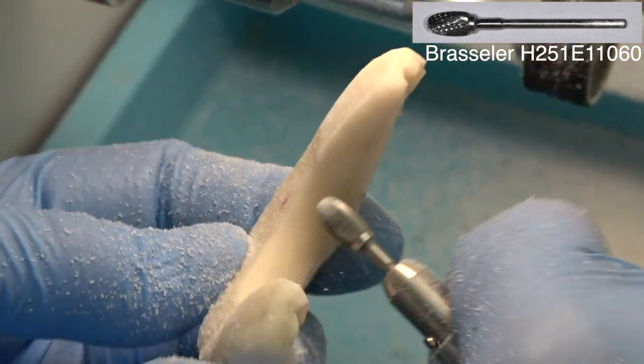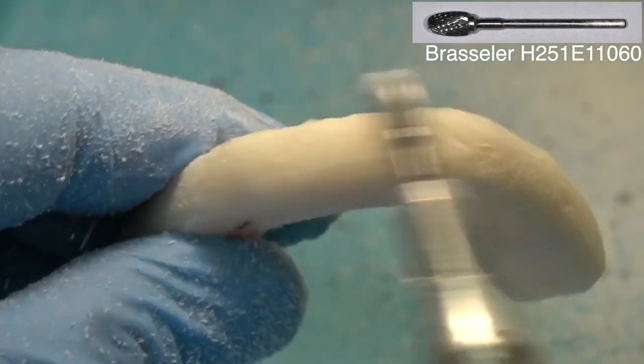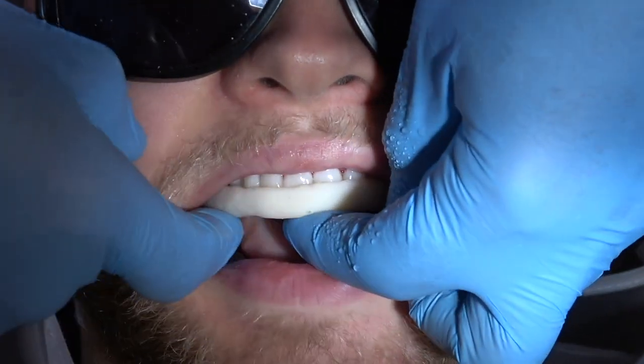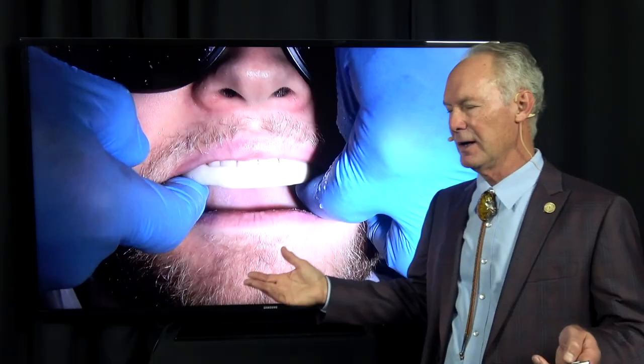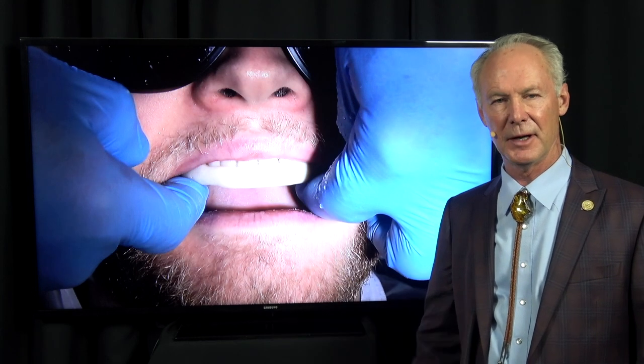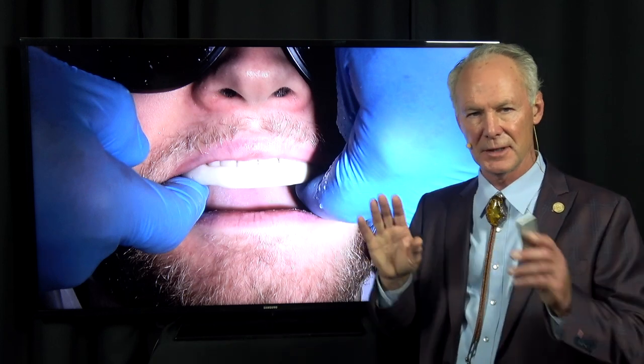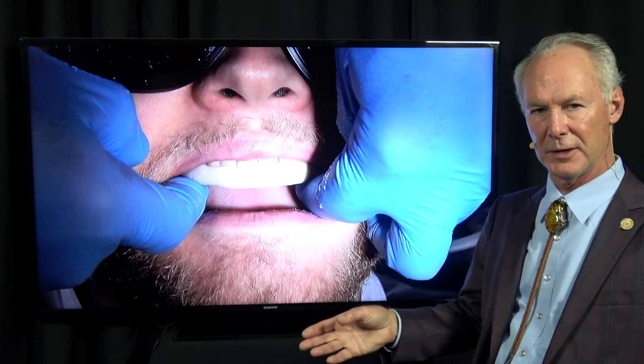Now I'm adjusting the night guard. I call this an investment protector. If a patient says they don't want to wear a night guard, which barely happens, but if they said that, I say, thank you very much. You're like an annuity plan for this practice, because look what you did to your teeth. You'll do the same thing to your restorations.